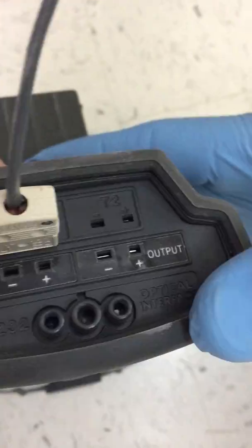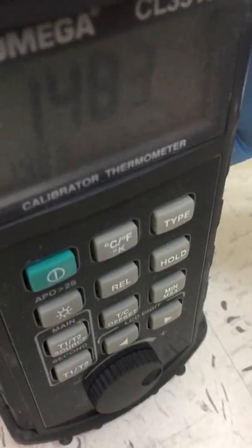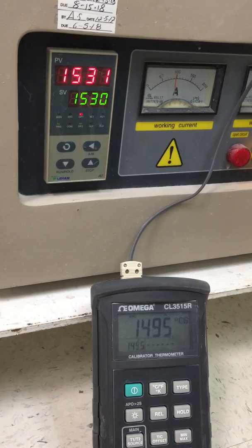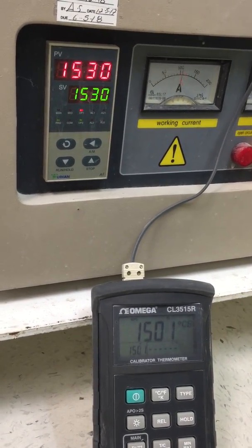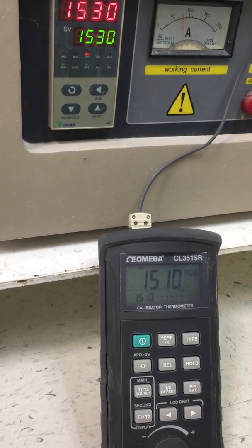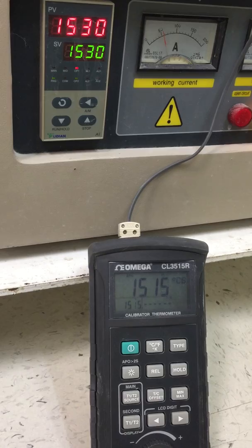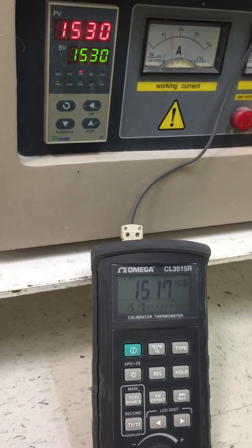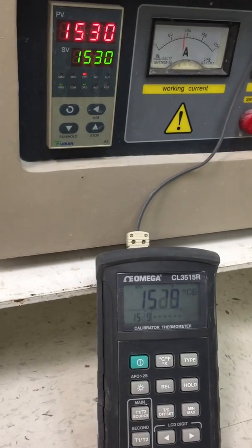It's climbing up. How often do you calibrate this? Every six months.